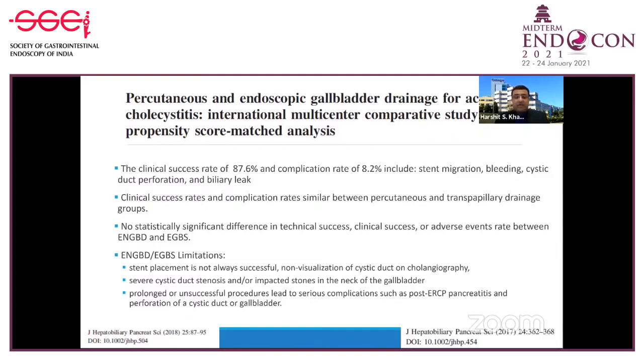The limitation with this technique obviously is that stent placement is not always successful. This could be because of non-visualization of the cystic duct on cholangiography. There could be severe cystic duct stenosis with impacted stones at the neck of the gallbladder, which may impede the placement of a guide wire or an endoscopic stent. Another issue is the risk of serious complications, which usually arises from prolonged or unsuccessful procedures. This risk includes post-ERCP pancreatitis or perforation of the cystic duct or gallbladder.